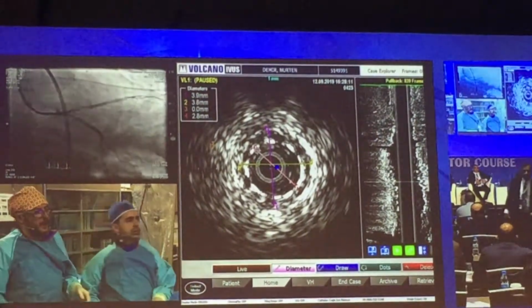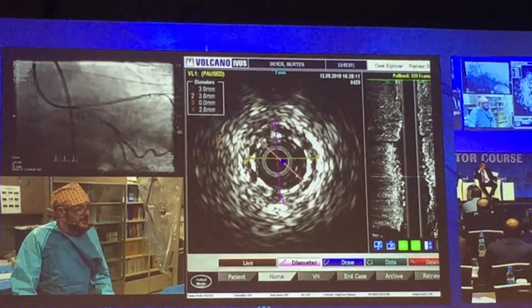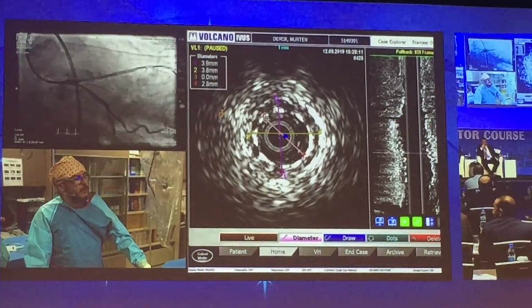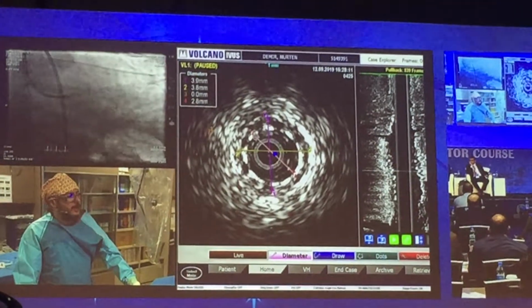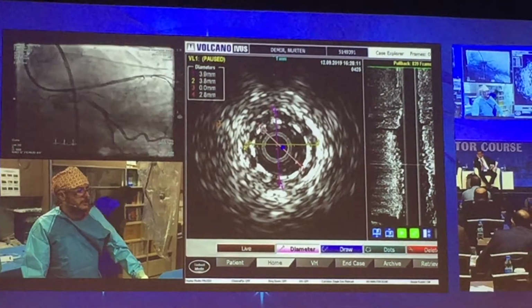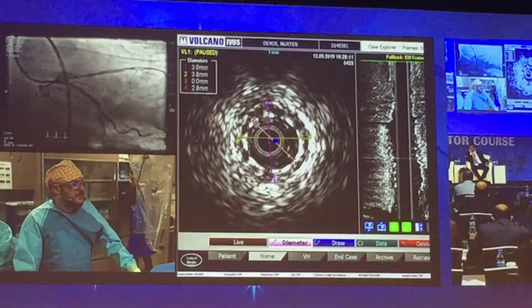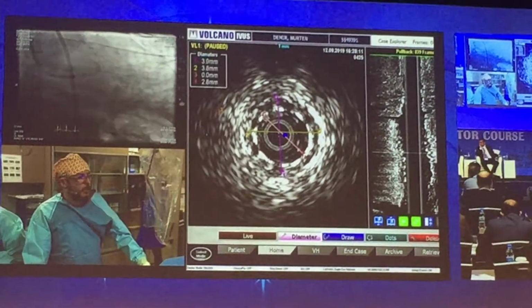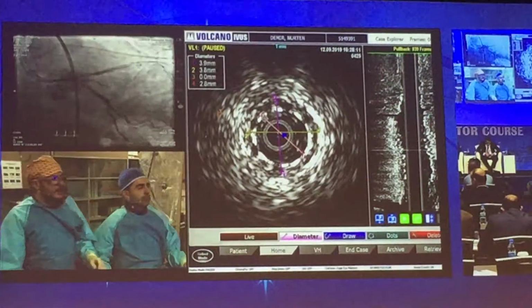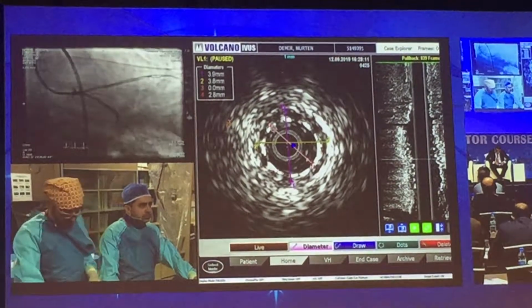Let's repeat the IVUS for the distal segment. Check it out. This is for sure the lesion. Okay, yeah, we will do that. But when you see the retrograde collateral visualization of the LAD before the CTO attempt, you will also see that this segment is diseased.